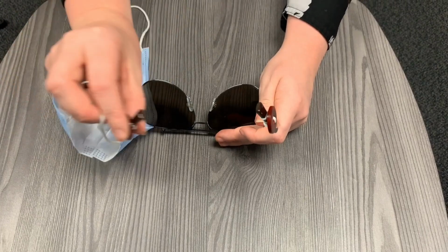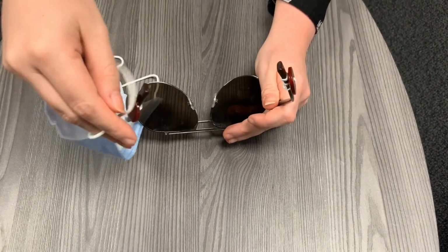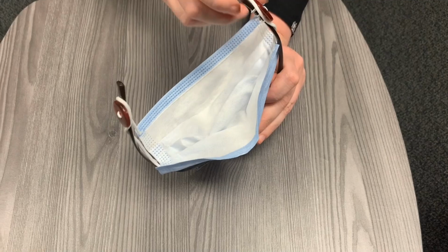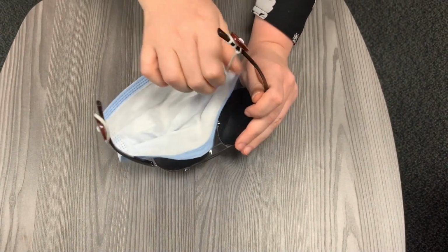Okay, so once you have the buttons attached, you're going to take your mask and all you're going to do is just wrap it around the button. Nice and easy. Just like that. And then put it on your face.